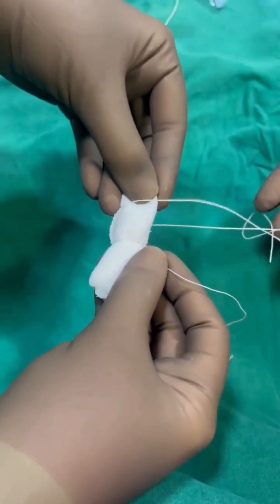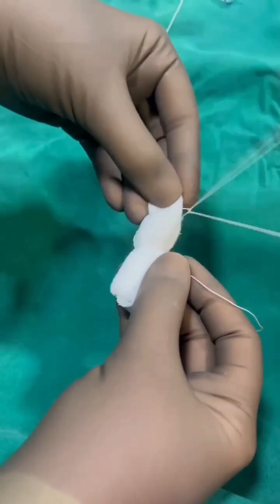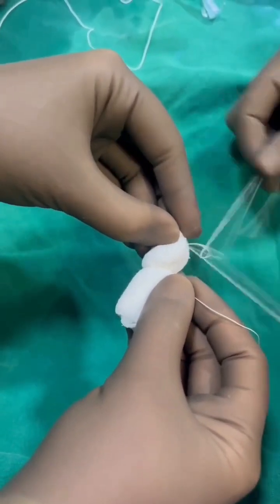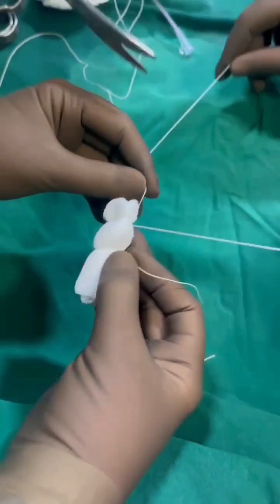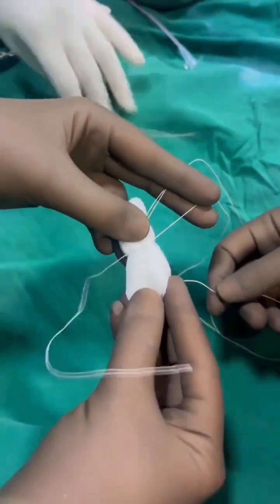The ideal size of this bolster should be about the thumb of the patient, so we can take one or two gauze pieces. It also depends on the amount of nasal bleed and how much pressure we need to give. We will tie three threads on the gauze.